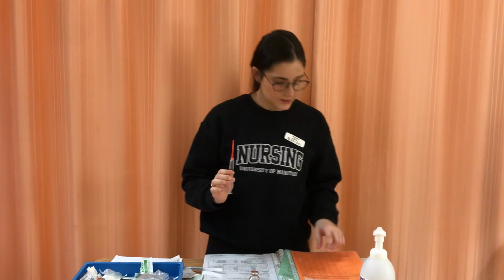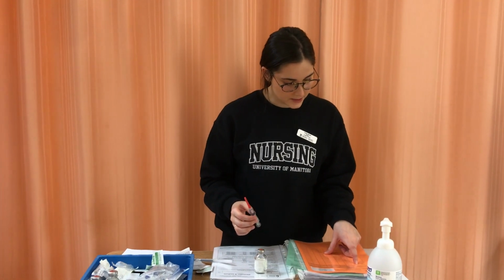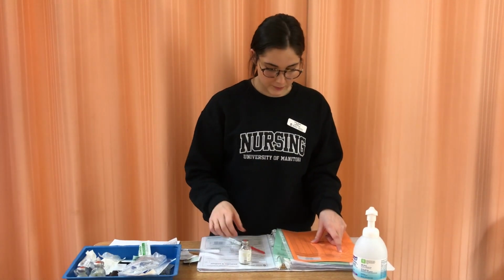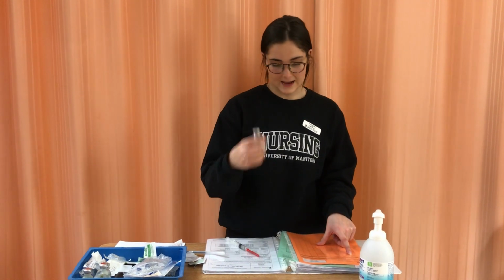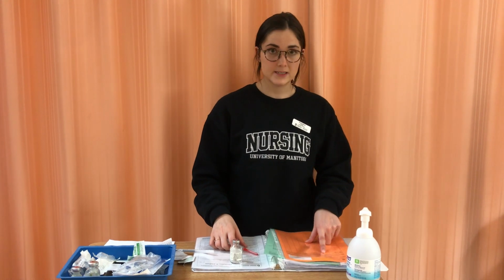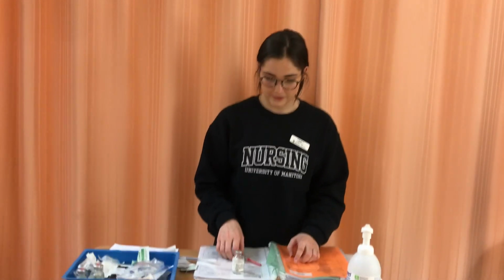Okay, so I'm going to do my second check now. So we have Penicillin G Sodium, 3 million units. This is a 5 million unit vial, and we just pulled it up, so we have 3 million units in here. It's IV, this is good for IV, and this is going to be injected into a mini bag, so it's good for IV. And the time is now, it's due every 4 hours, and it has not been given yet, and we have the right patient here, which is Frida Fritz.